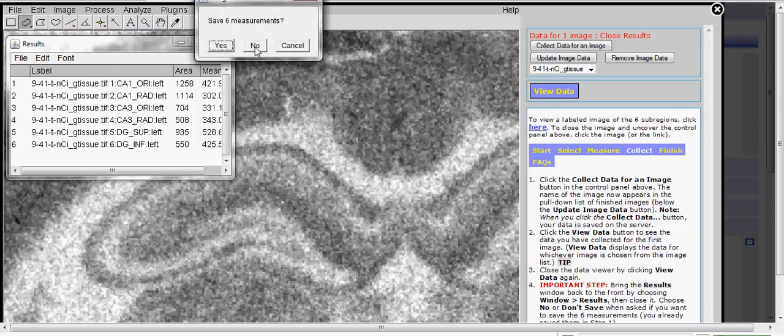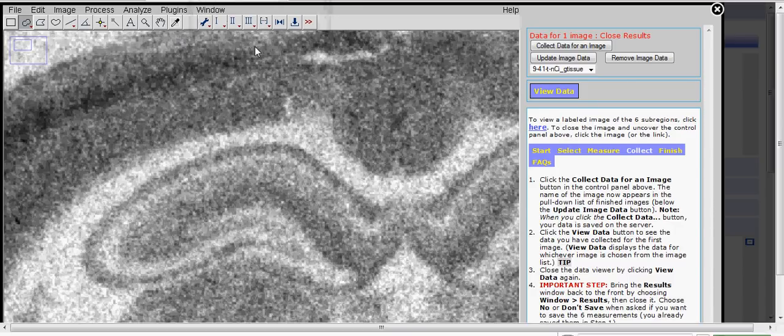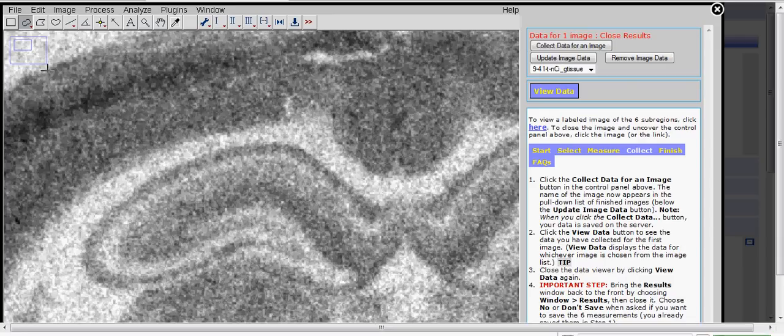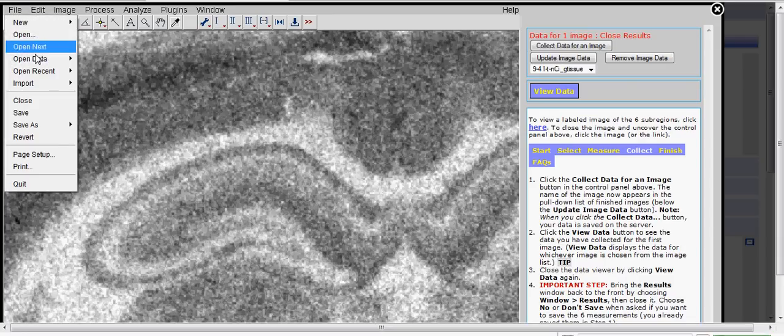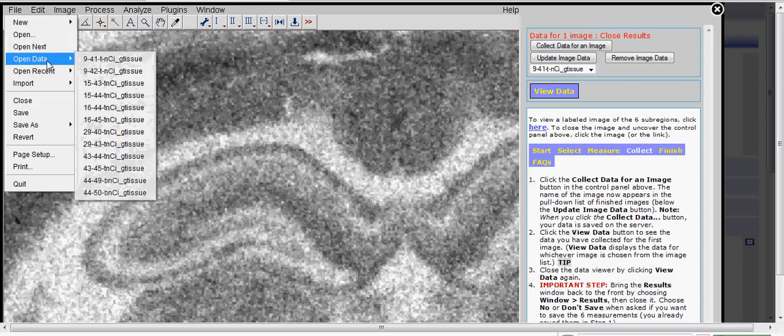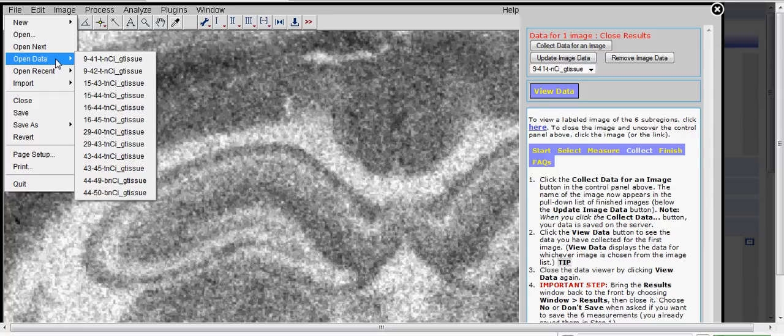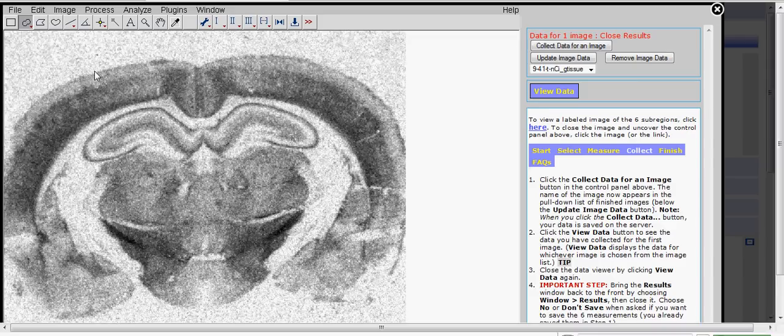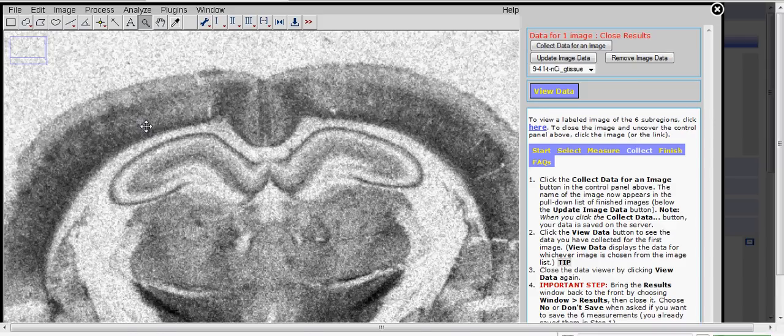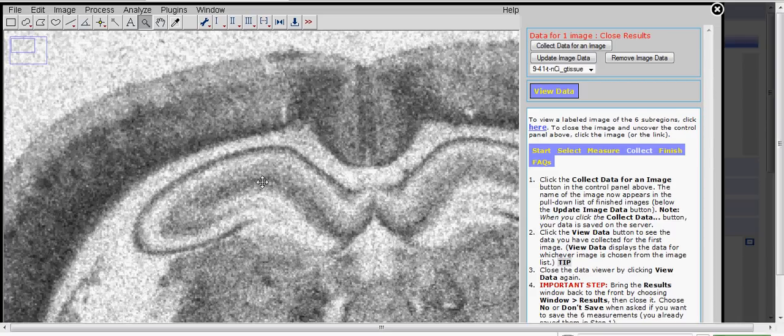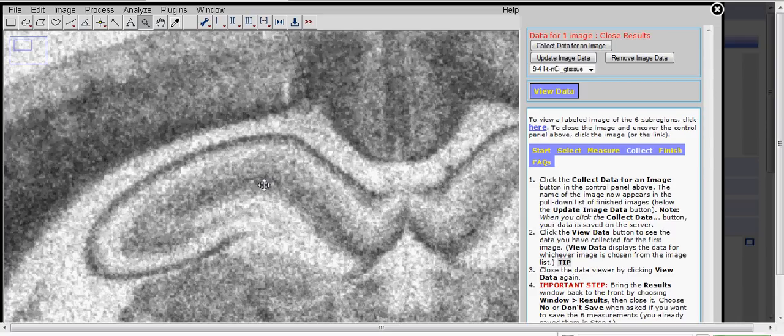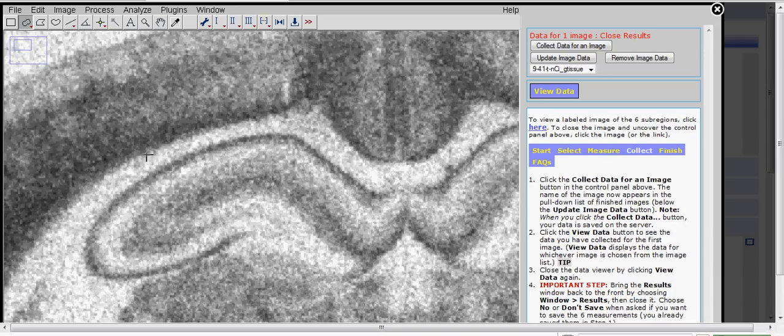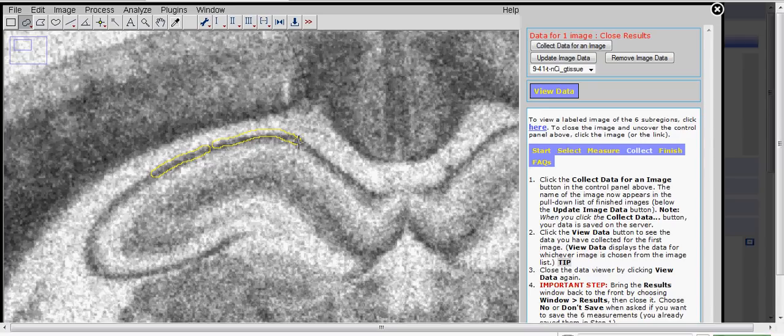You're now ready to collect image data from the second image. You don't need to close the first one, you can if you want, but we'll just open the second one and you're ready to start the process over again. Zoom in, select your brush tool, and start selecting and labeling each of the six regions. When you get done collecting the data from all 12 images, then you're ready to close ImageJ Applet and move on to the Statistical Analysis section of the lab.